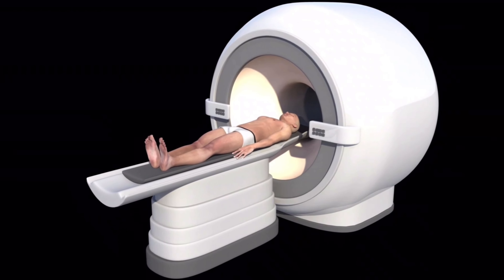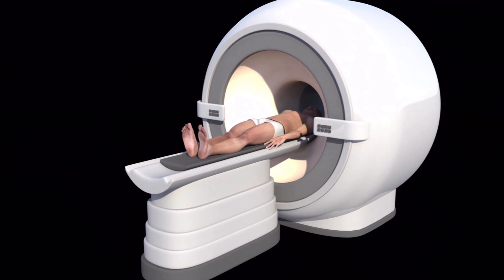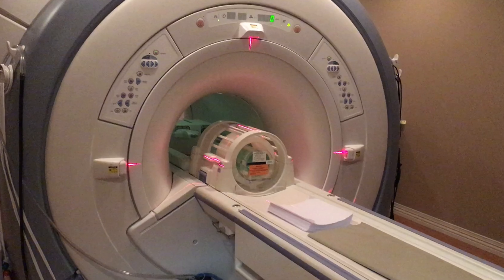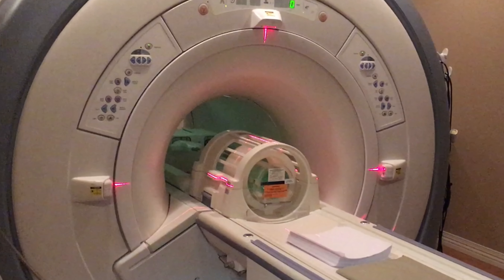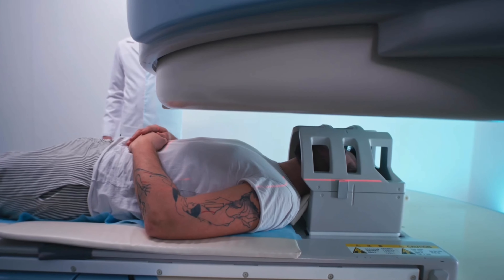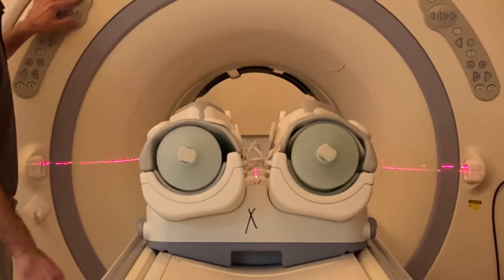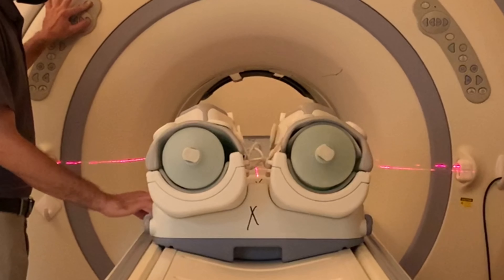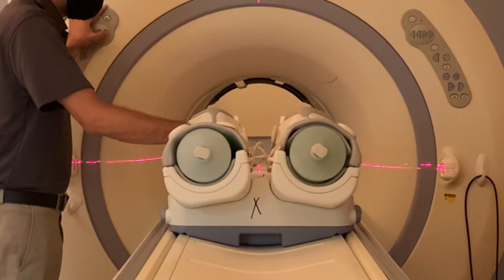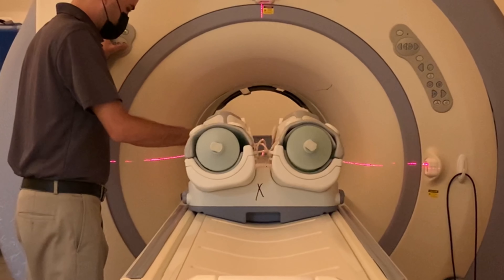MRI scanners require precise anatomical placement into a near-perfect magnetic field environment to produce crisp, clear images of the anatomy. This is accomplished by using a laser crosshair assembly to mark the precise location of the anatomical region of interest on the patient. The laser crosshair assembly is calibrated to a known distance from the magnet isocenter, so that when the MRI procedure begins, the patient transport assembly can move the patient into the exact position needed inside the MRI scanner.